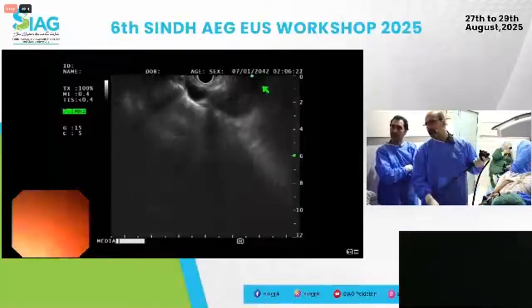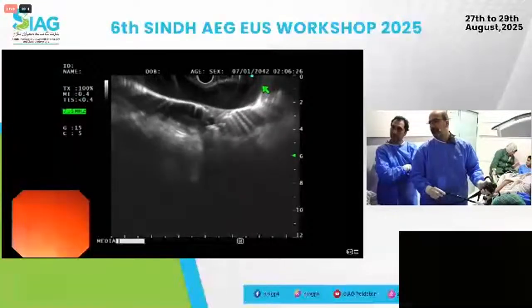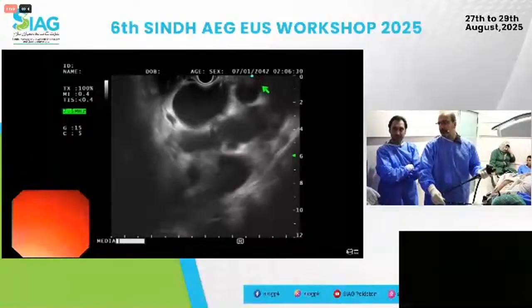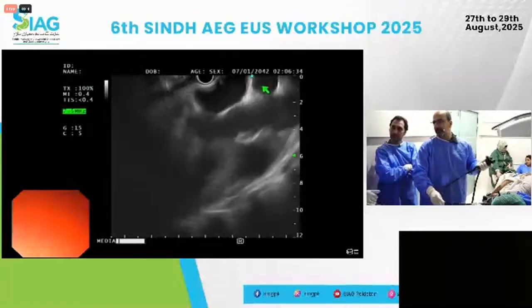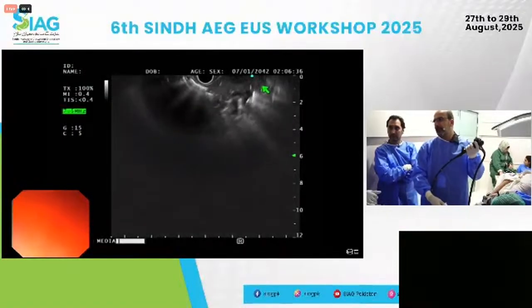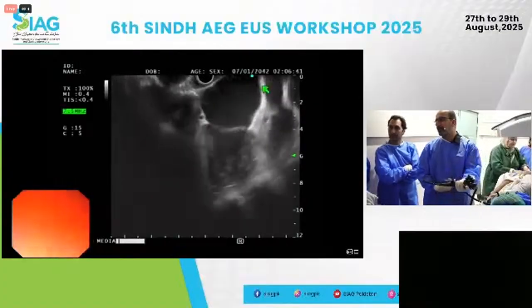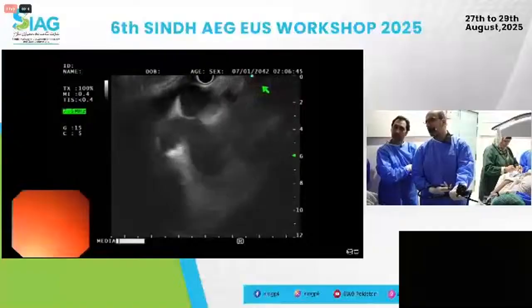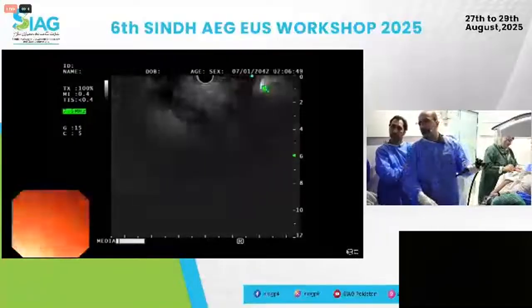And so there's always some sort of a node here, usually small, nothing major. That's your aorta. And the way I was taught EUS was that you should be able to do a 360-degree turn. So if you're here at the left atrium, you should be able to go clockwise all the way across the aorta, aortic reflection, and back to the left atrium. Then you pull back a bit, and you can now go the other way. So you do a complete 360 evaluation.